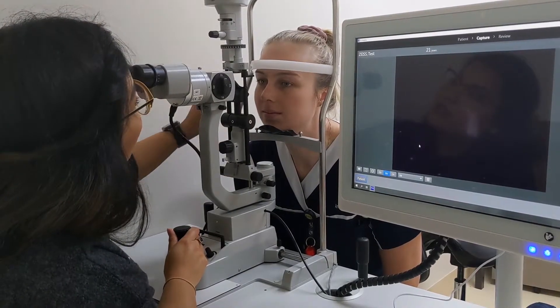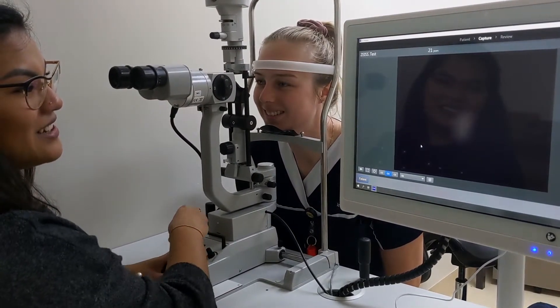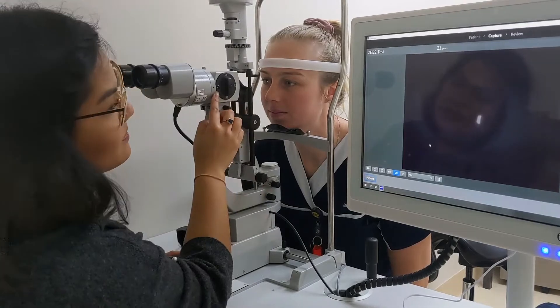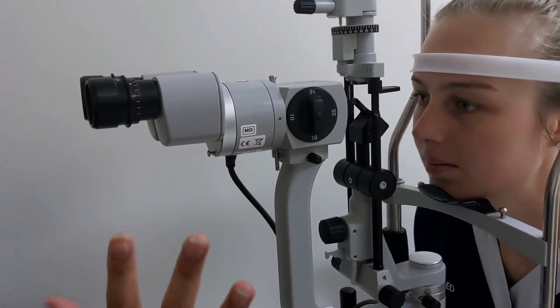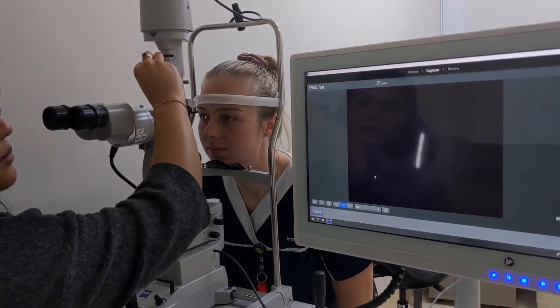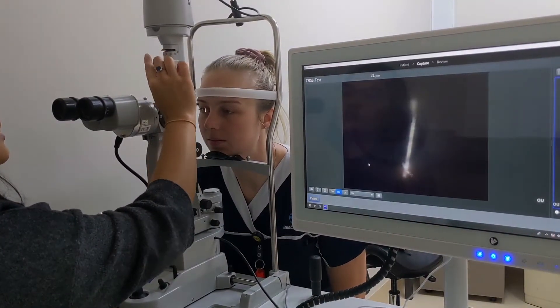I'll bring you down a bit, Kelly — make sure your head touches the top, perfect. We're a bit magnified out, so you want to start at the lowest magnification and then move to higher magnifications. My slit is quite small, so I want to change the length of it using this top knob here.